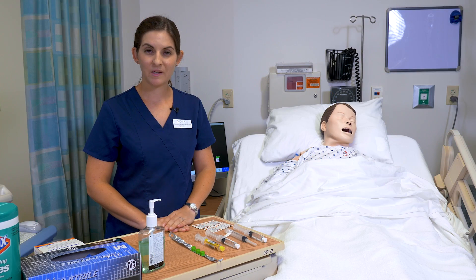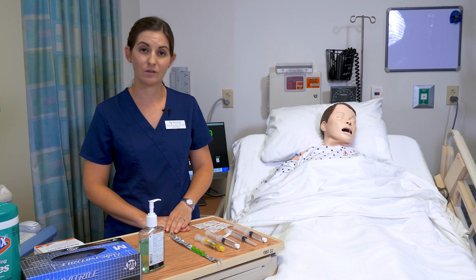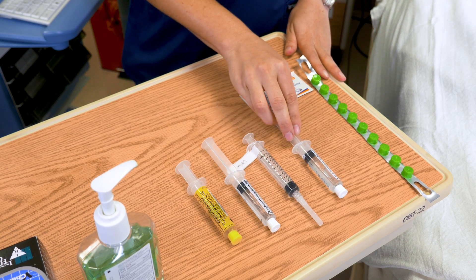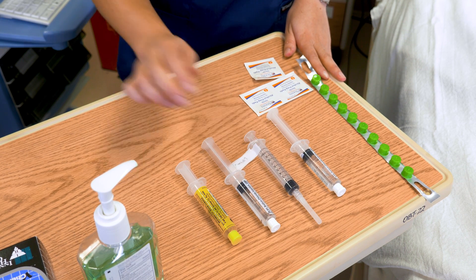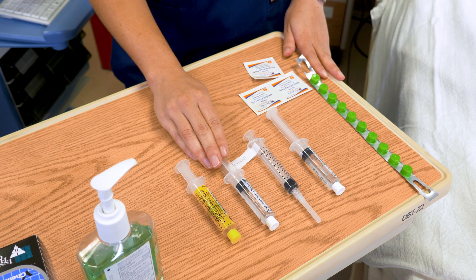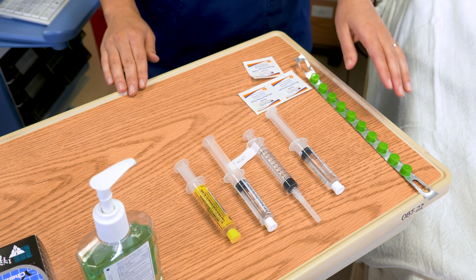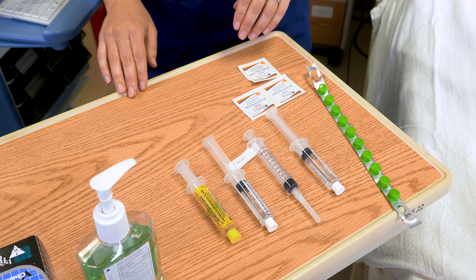Next I am going to demonstrate how to flush and administer a medication through a central line. I have gathered all of my supplies. We have our first saline flush, then our medication, our second saline flush, and our heparin syringe. We have curo caps to replace and alcohol swabs.